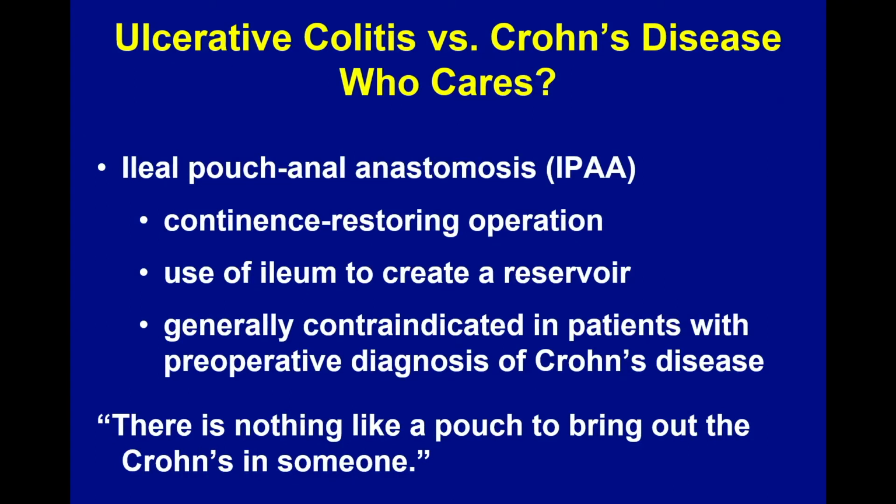Honestly, this seems to be the exception, not the rule. In terms of how straightforward it is, the longer I've done this, the more I think this is not as easy as most of us were taught in medical school and in residency. I think it can be really difficult to separate Crohn's from UC, even when you have a resection specimen. I'm going to be focusing on biopsies and telling us what our limitations are. So, do you get requisitions that say UC versus Crohn's biopsies, and they want you to try to tell the difference? And the question is, well, why do they even care?